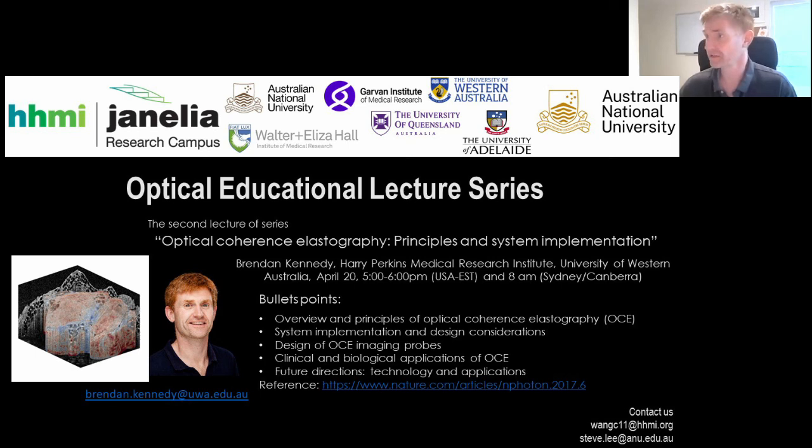We could utilize similar techniques where from each realization of speckle, we have an accurate measurement of displacement where there's a bright speckle. If we compound a number of speckle realizations, extracting our displacement only from the bright pixels and putting them together, I think that will dramatically increase the accuracy of the axial resolution, but it requires more data.